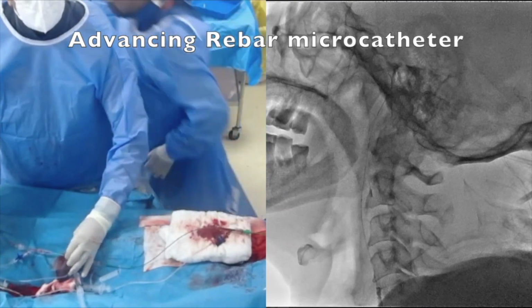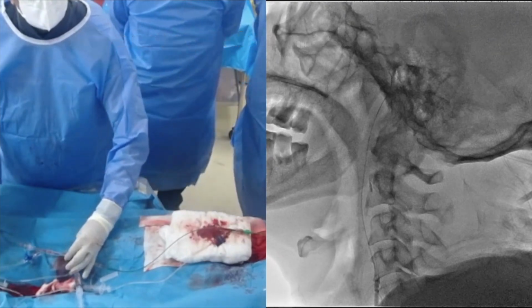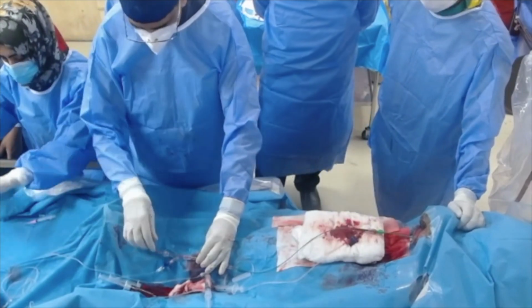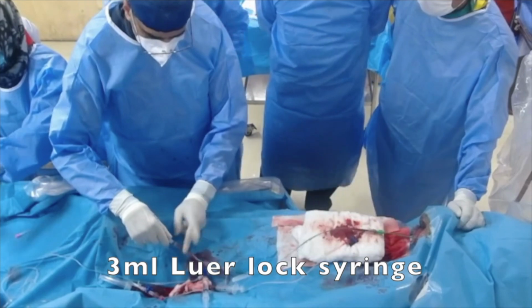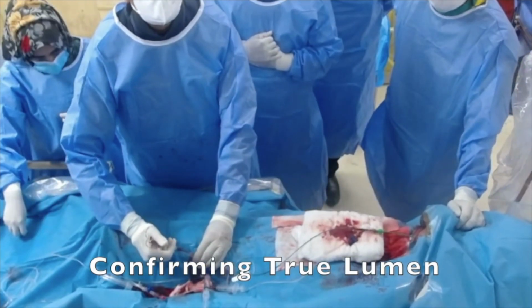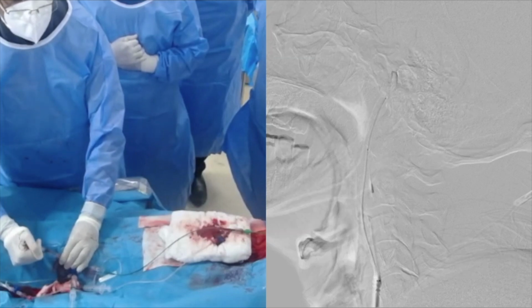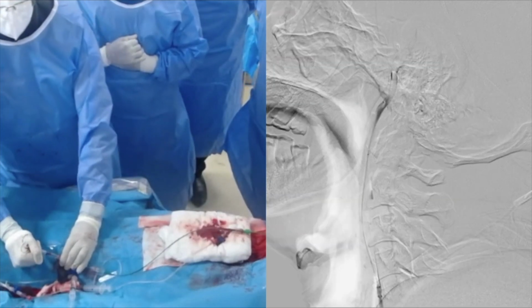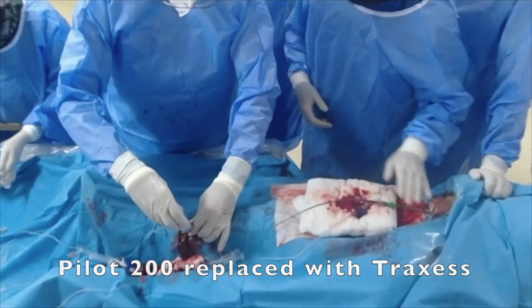and then took a 3 ml Luer lock syringe with contrast, looked for back bleed, and once I confirmed that there was back bleed, I took a careful injection with the 3 ml syringe, and that confirmed that I was in the true lumen. I then exchanged the Pilot 200 wire with the Trexus wire.